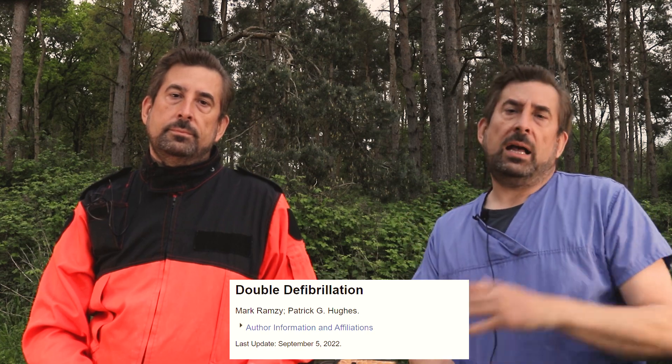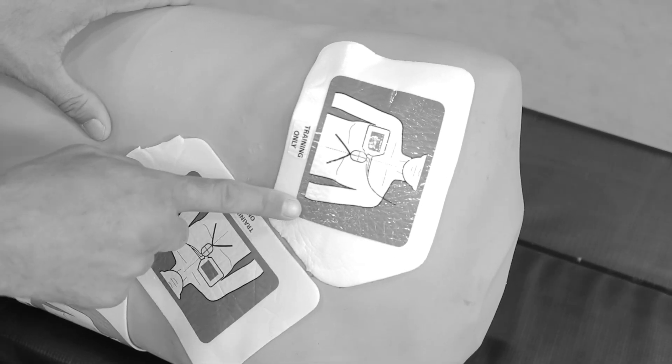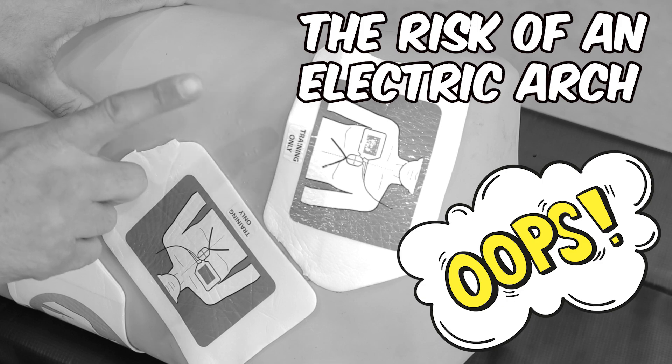There's one more thing. Dr. Ramsey pointed out that the use of two sets of pads, especially in smaller patients, creates a risk of an electric arc. This is manufacturer-dependent, but please remember that the minimum separation between pads is usually four centimeters.